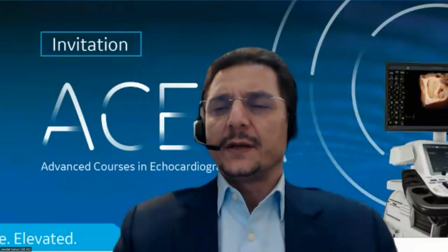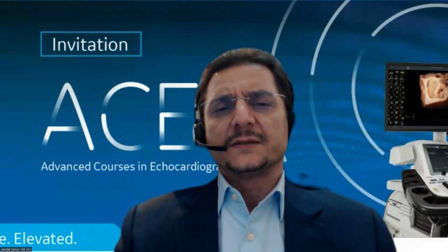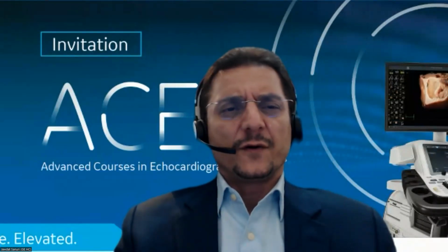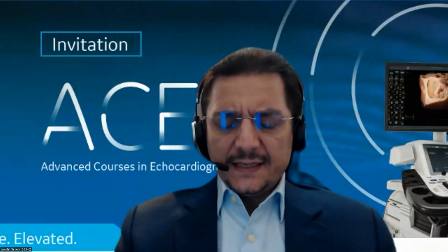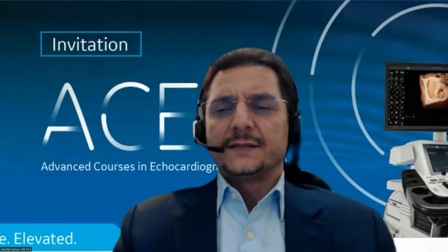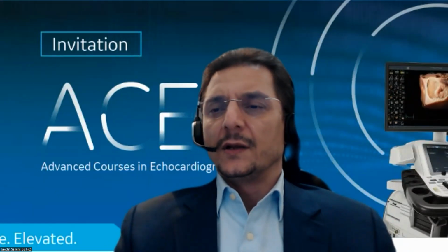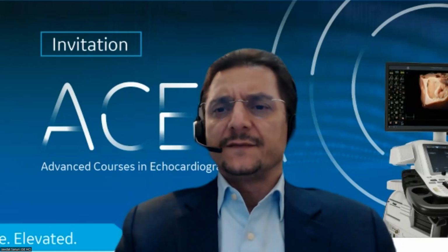Okay, thank you. In the meantime, do you have the standardized Z value for the strain test? I didn't find it. Where can I find it? In the Vivid Club, we have all the literature and white papers with the actual values as per the EACVI protocols. So the values are there in the white papers and the clinical papers. I think there's also an application for the ESC that indicates all the normal values, and GLS is one of them. I remember one of your colleagues showing me this. It's a phone app that has the standard values even for things like diameters, ejection fraction, strain, and all others, for adults, for pediatrics, for males, females, and so forth.